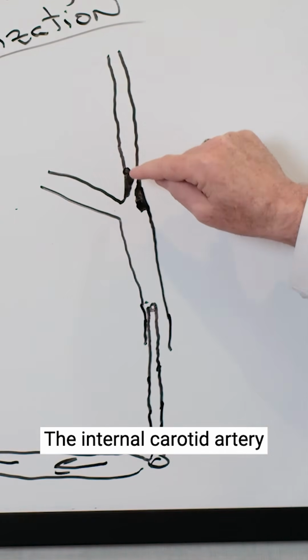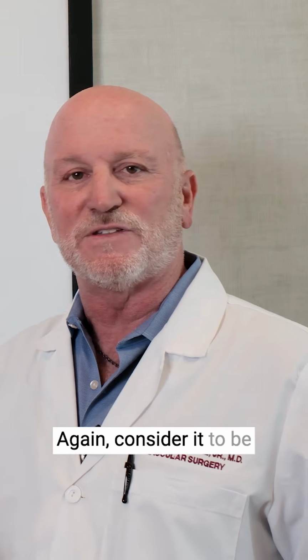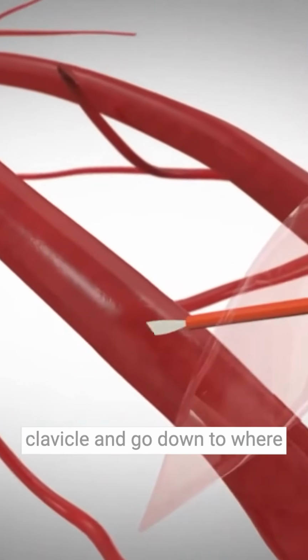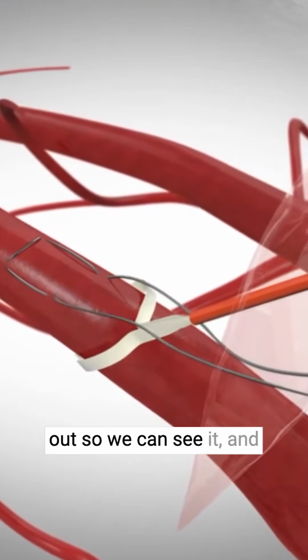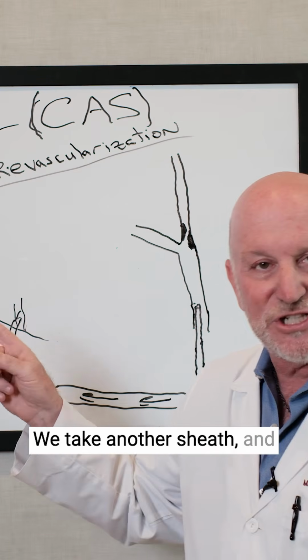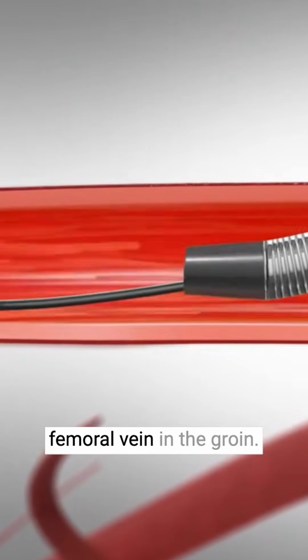The internal carotid artery goes up in this direction, and you can see there's a blockage here and a narrow channel that's right there. Again, consider it to be greater than 80% blocked, at least in an asymptomatic patient. Once we get exposure to the artery from just above the clavicle and go down to where the artery is, get the artery out so we can see it, and then a device goes into the artery, which is a sheath. And that's what this represents. We take another sheath, and using ultrasound to identify the vein in the groin, we put a sheath in the common femoral vein in the groin.